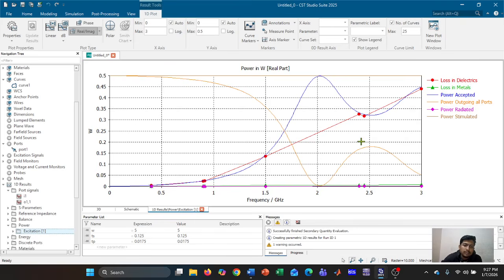So this graph shows what happens to the power I send into the antenna. Most power is absorbed by human tissue. Very little power is radiated. You can see almost no power loss in the metal. Human body tissues absorb energy, so low radiation is expected for implanted antennas.